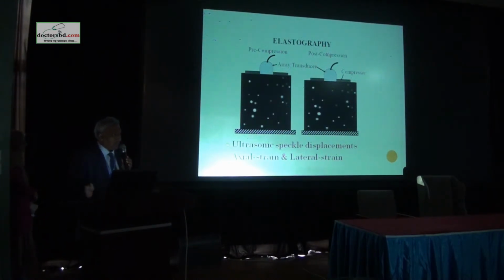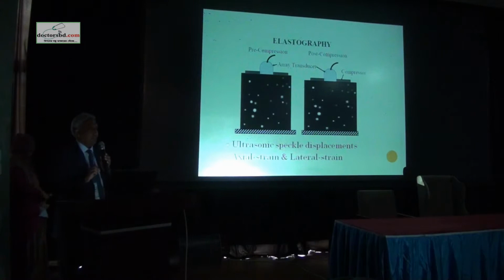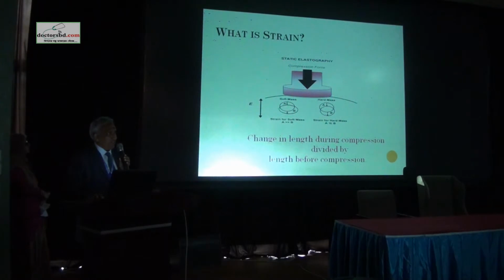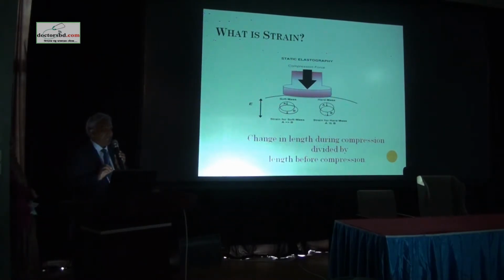You can understand further by two models where particles are spread in the tissues. When you press upon the tissue, you see deformation in axial as well as lateral direction. That is what happens in elastography. Deformation of the elastic properties of normal tissues takes place. Again, to make it clearer, look at those two models in the soft tissues. One is soft, the other one is hard.